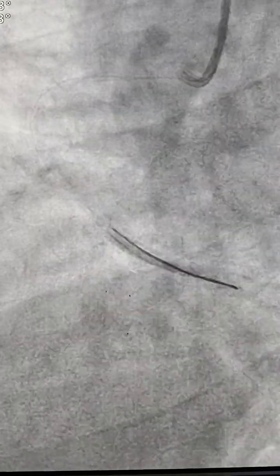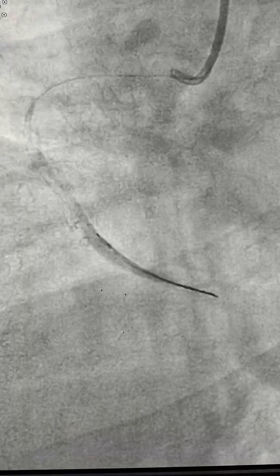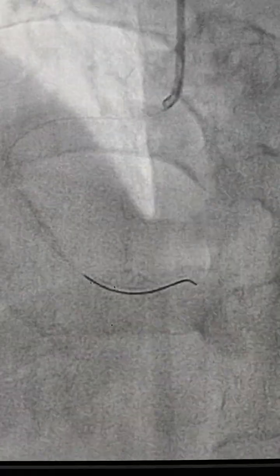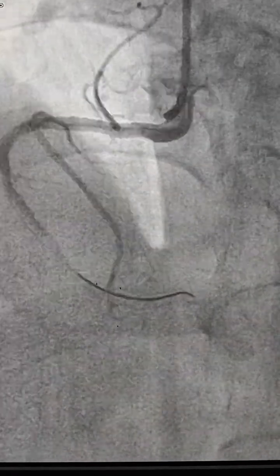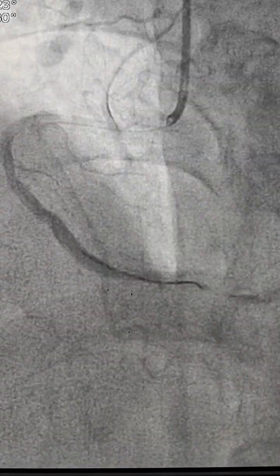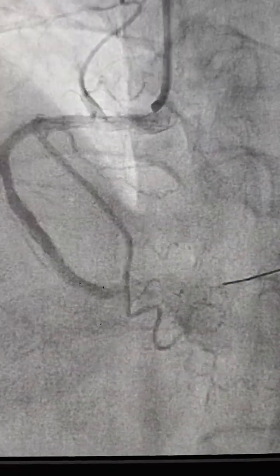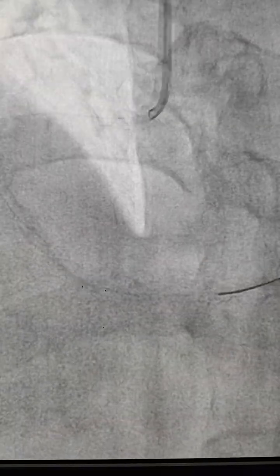I was trying to put the wire. This is a simple workhorse wire, but I was unable to cross the wire from this point. And at this point, you can see some flow has come, and I could see the PLV, but the lesion, the plaque rupture site, was heavily loaded with thrombus. Then I could cross the wire, but you can see there is very minimal flow in the distal RCA. So I decided to do balloon daughtering and balloon inflation.